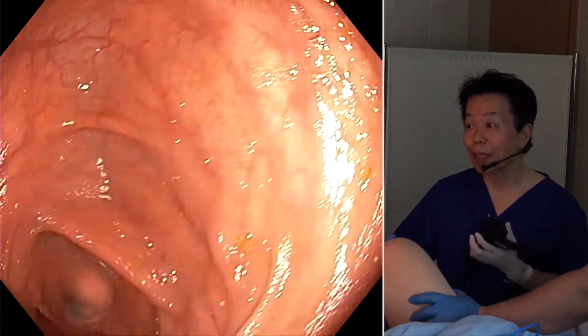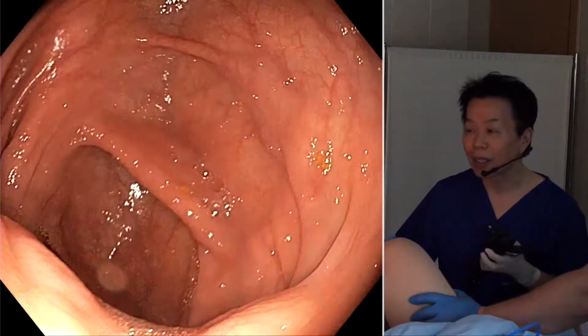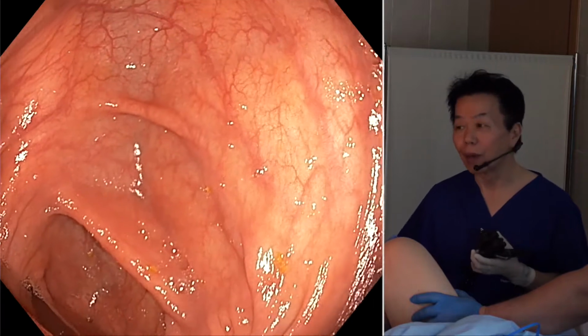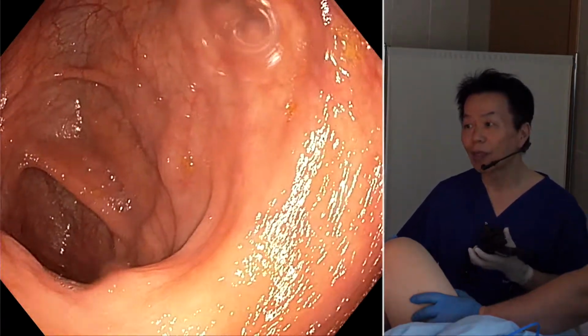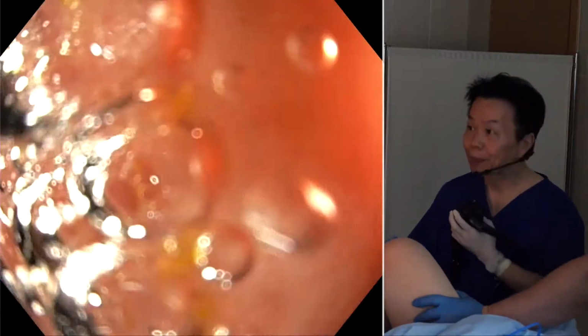Sometimes you might make mistakes. So even if you think you have reached the cecum, maybe it can be the hepatic flexure or the middle part of the transverse colon. So you must be very careful. Anyway, so let's go back.